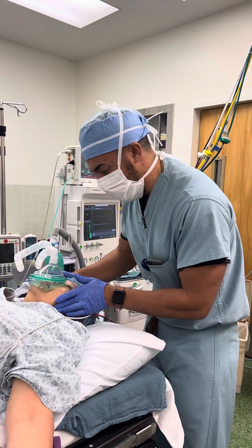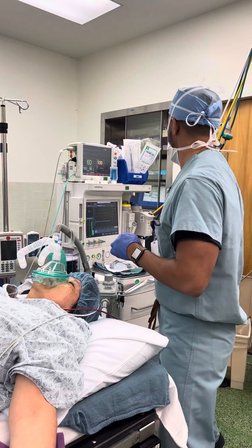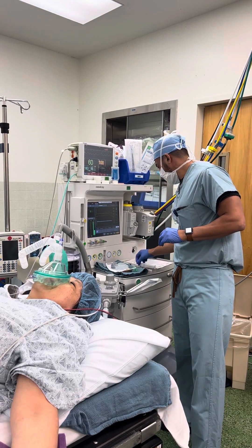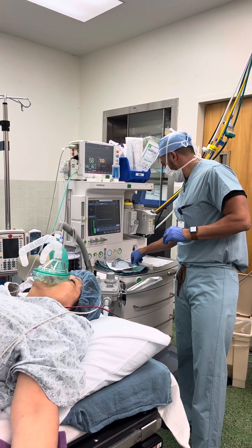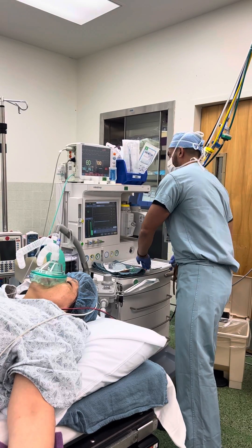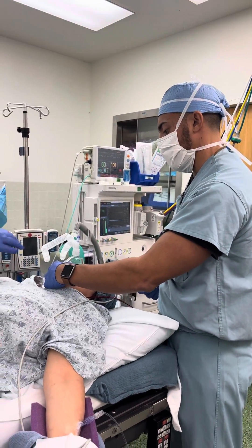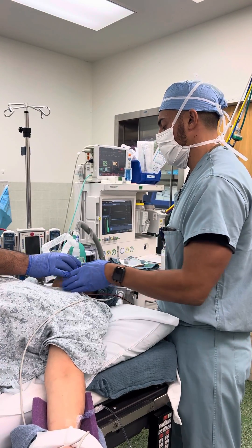She's been breathing pre-oxygenation. Big deep breath. Big deep breath. Another breath. Big deep breath for me. Big breath. Just like that.